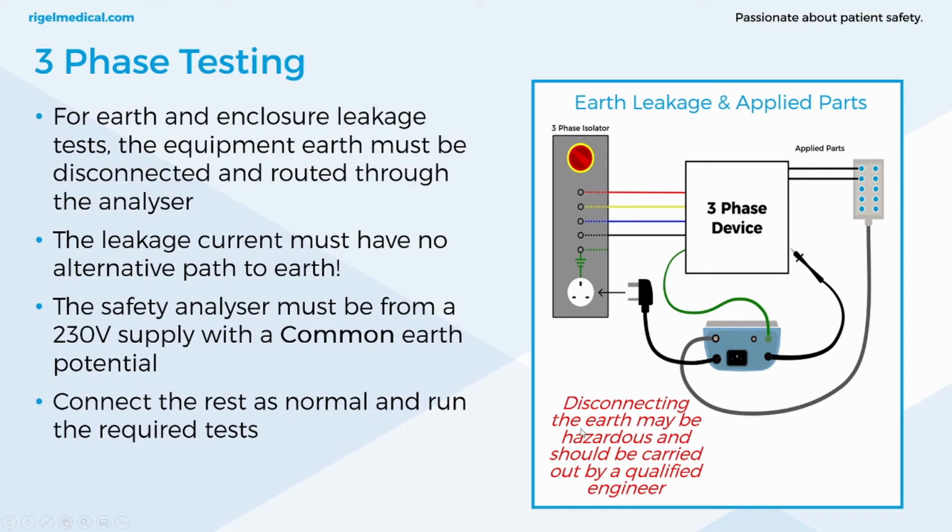One important note as well, three-phase distribution systems are used as they are more efficient for high power devices such as MRI and CT. They need that power, but obviously because of that power they're considerably more dangerous. In the UK it operates at around just over 400 volts and should only be changed or modified by a fully trained and qualified engineer.